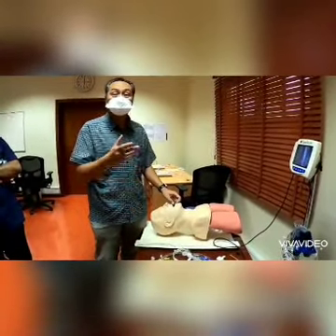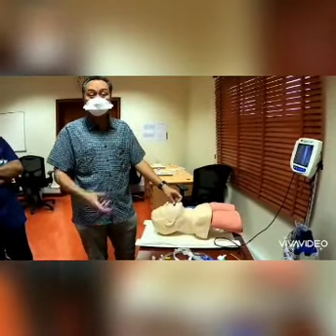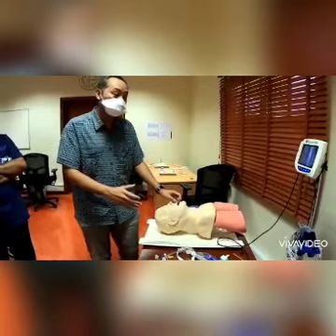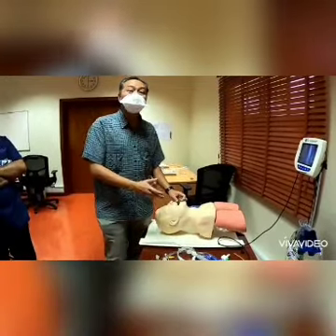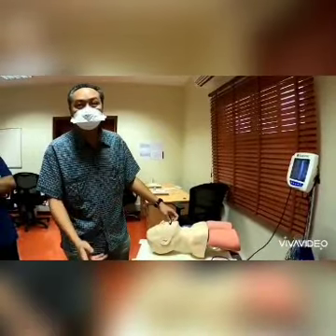So another simple measure to use to decide when to abandon attempts at intubation is by using the heart rate. If you sense the heart rate is starting to go down, in other words, you start off with a heart rate of 120, slowly going down to 110 to 100, then at that stage, I think you should declare you have failed to intubate this patient and move on to laryngeal mask or surgical airway, because you don't want the patient to reach bradycardia of 50 or 60, because that's a pre-arrest situation.